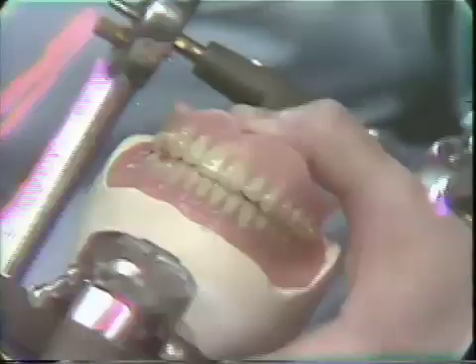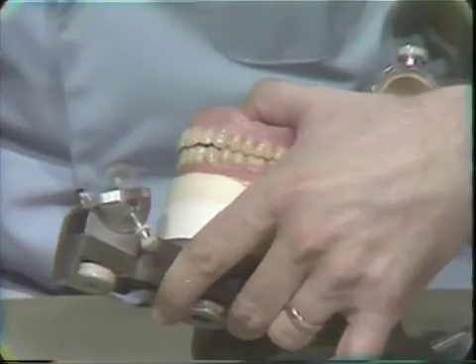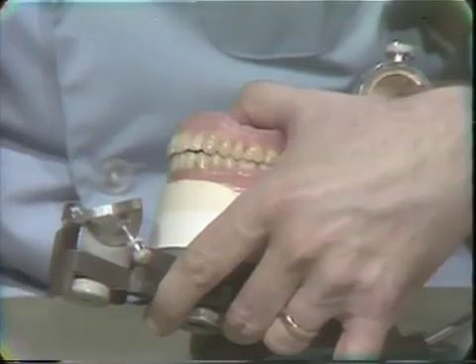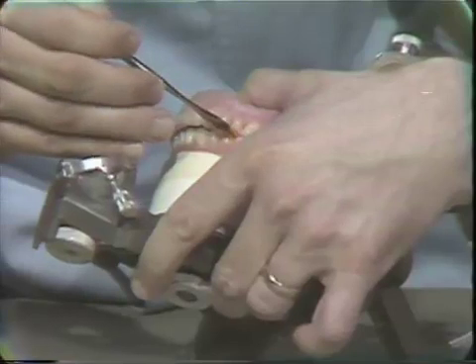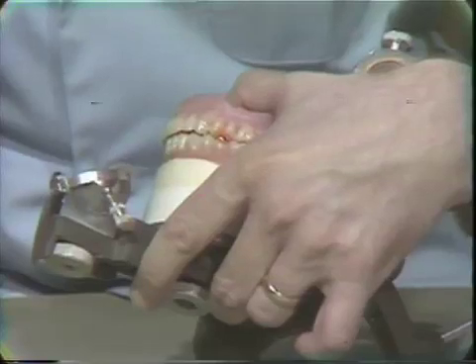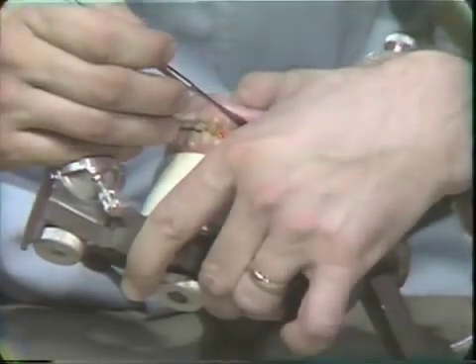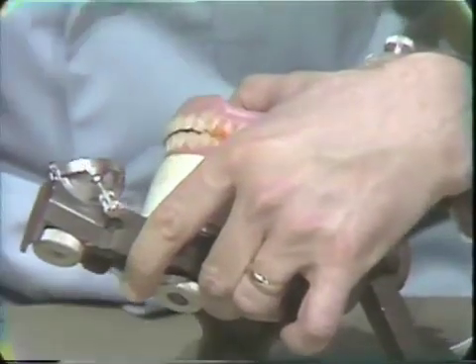You only need the sticky wax in a couple of spots. Give it a chance to cool and then we will go to the other side and do exactly the same thing. Now before we add plaster to this upper denture, it is important that we remove or don't put the plaster in large undercuts. In this particular Technic case we don't have large undercuts, but it would be much easier if we did remove that little bit of undercut we had in the labial vestibule of the upper.